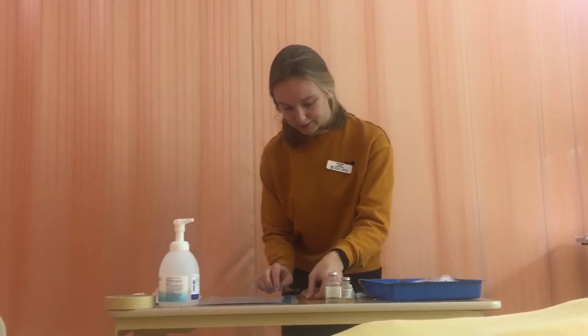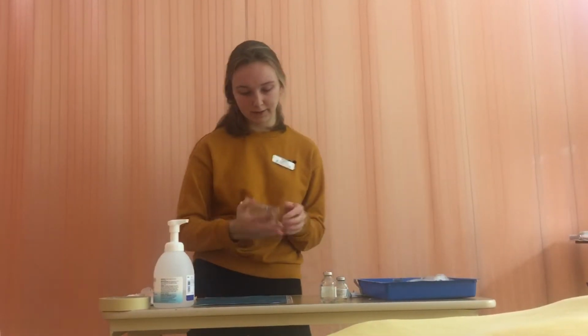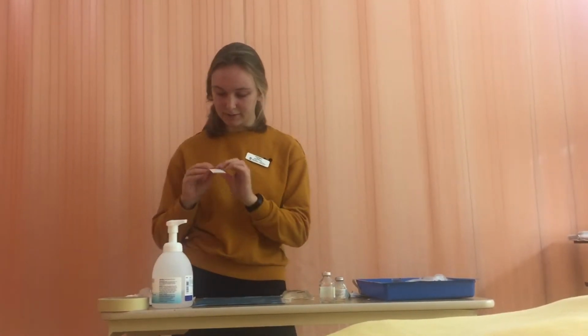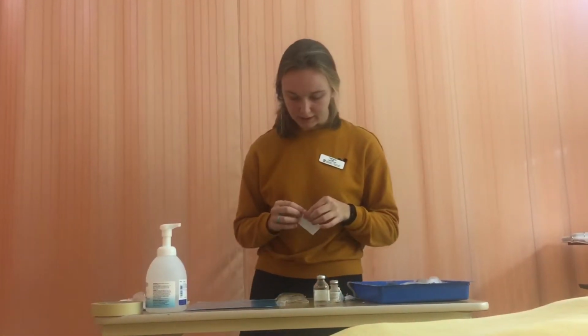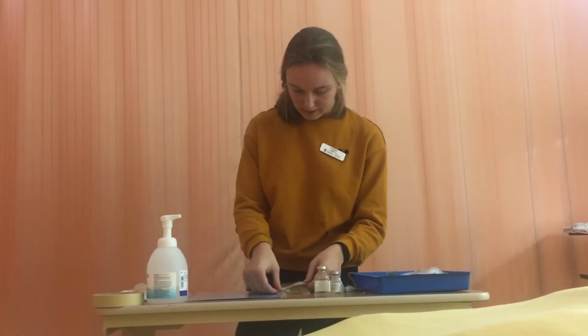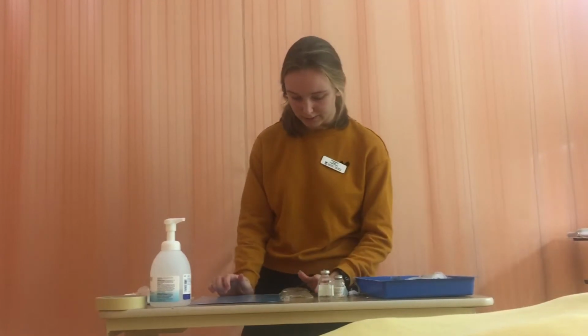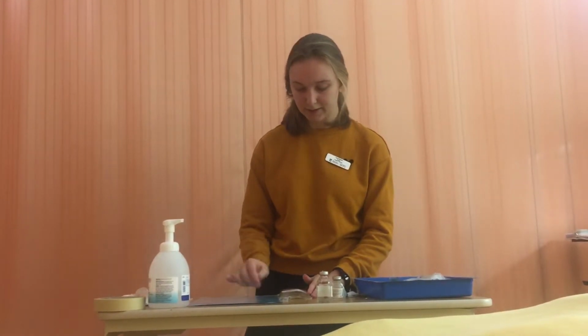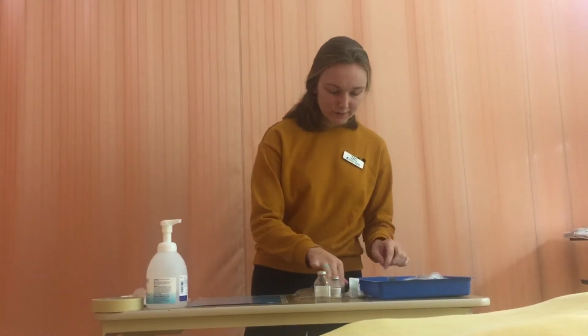Remove the needle and throw this away into the sharps container. Now I'm just going to mix the mini bag around to make sure the medication is distributed evenly throughout. And I'm going to add the medication label to the top. So now we know that the total volume of the mini bag is 106 milliliters, and the total concentration of medication in the bag is 28,301.9 units per milliliter.